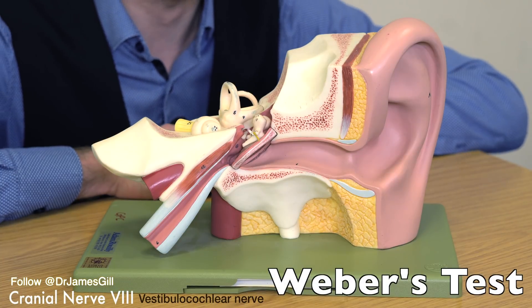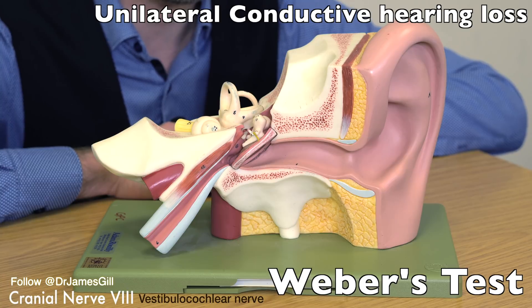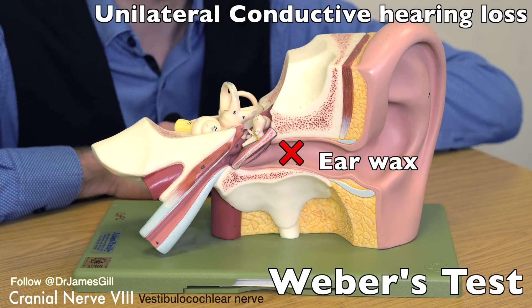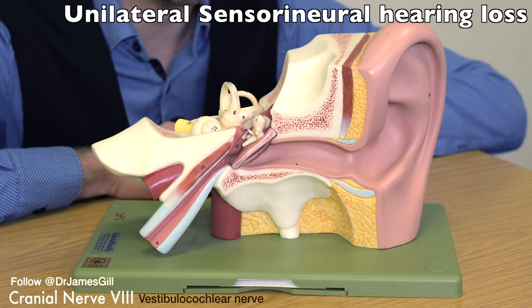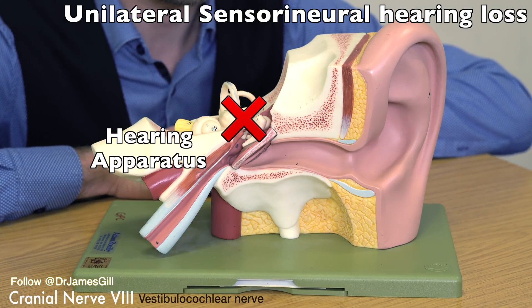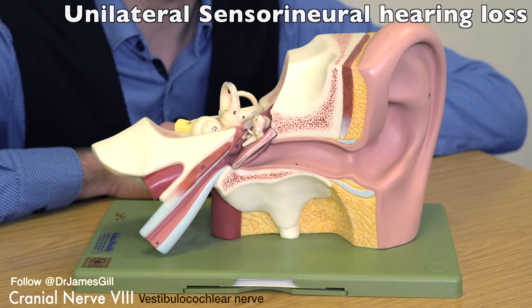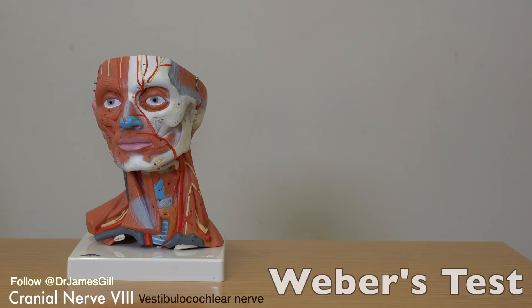Weber's test is performed using a 512Hz tuning fork and is able to identify unilateral conductive hearing loss — where something is blocking the sound going to the ear, the commonest example being earwax. Weber's test is also able to identify a unilateral sensorineural hearing loss, where the hearing is impaired due to a problem with the hearing apparatus, whether that's the inner ear, the sensory organ itself, or the vestibulocochlear nerve. It should be noted that sensorineural hearing loss is the commonest cause of hearing impairment, of which the most frequently seen is age-related hearing loss, or presbyacusis. A normal result for Weber's test would be the patient commenting that the sound is heard centrally or equally between both ears.